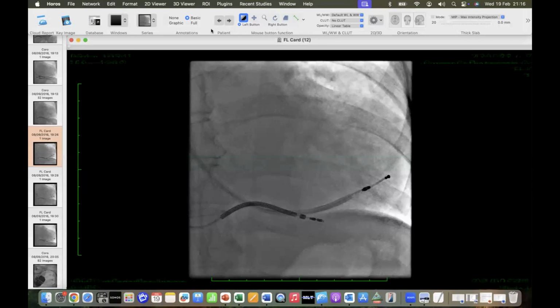Nowadays, there's a dedicated delivery system on the right side, coronary sinus implant. And I think that for this particular series is more important. I don't know what Muzahir would like to add to that question.